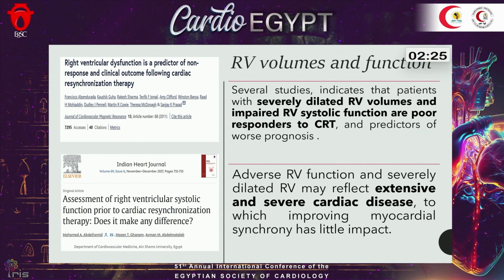What about RV volumes? Several studies show severely dilated RV volumes and impaired RV systolic function are poor responders for CRT and a predictor of high mortality and worse prognosis, as RV dysfunction and increased RV systolic volume indicate extensive and more severe cardiac disease beyond repair.